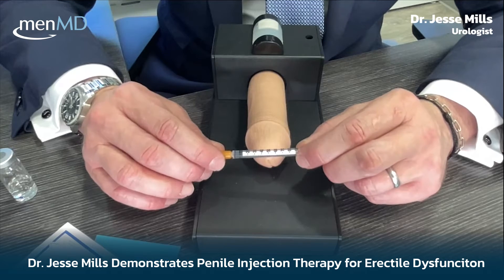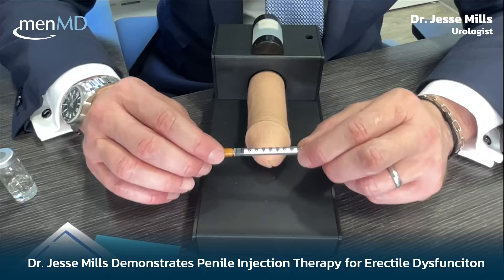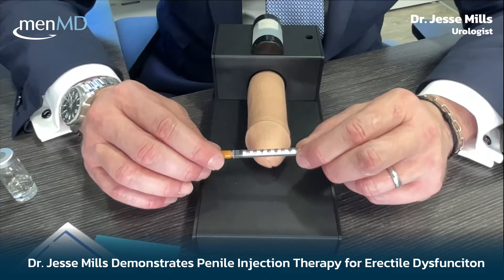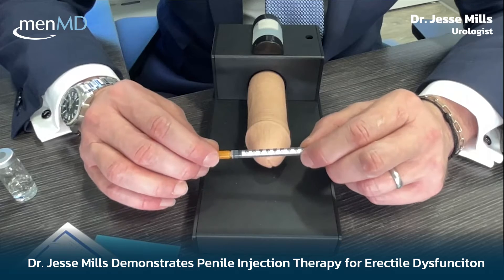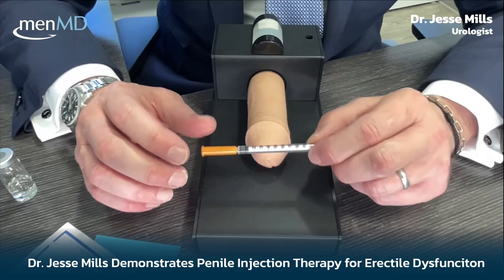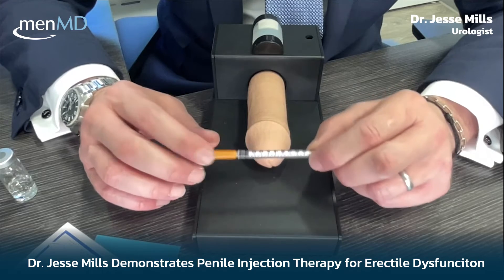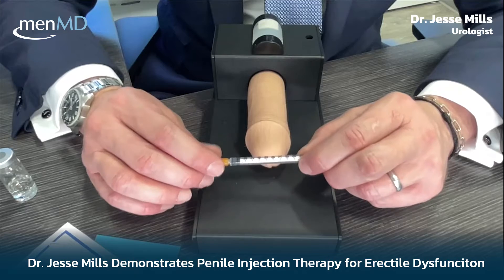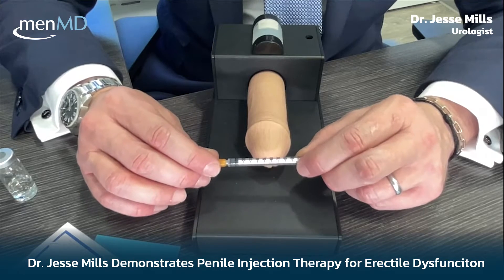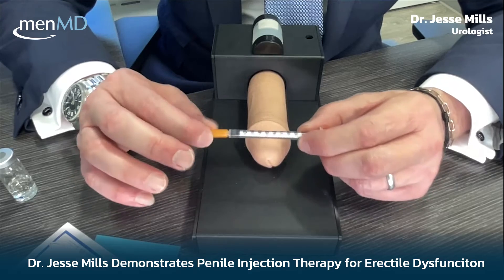Your prescription will specify exactly the dosing your physician recommends as a starting place. In my practice, we typically start somewhere between 15 and 25 units. For this video, we'll go with 25 units, which is a moderate dose. You can continue to go up on a standard trimix, but we'll start around 25 and see how it goes.